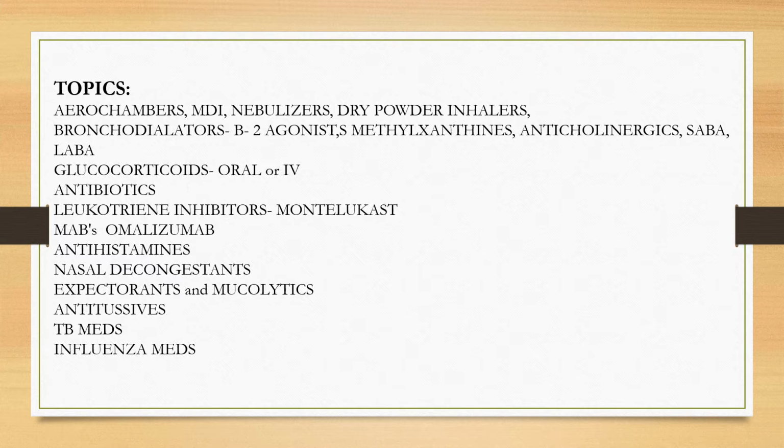So aero chambers. Well, an aero chamber is just to help patients get the medication of an inhaler into their lungs. Okay, and so we use metered dose inhalers of different medications. We attach the metered dose inhaler to the end of it, and the chamber is then put to the mouth. And when the MDI is squeezed, it puts the medication into the air chamber to then be inhaled.